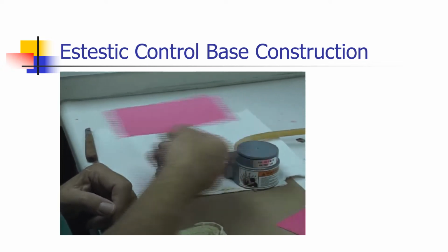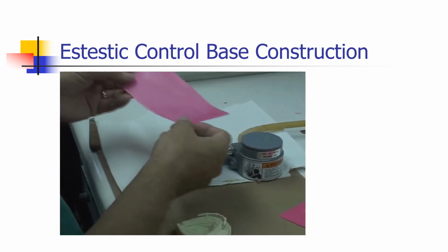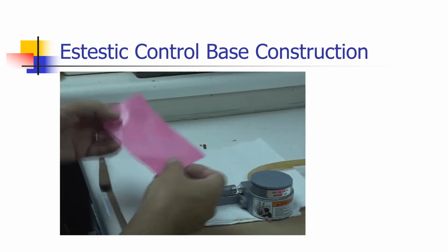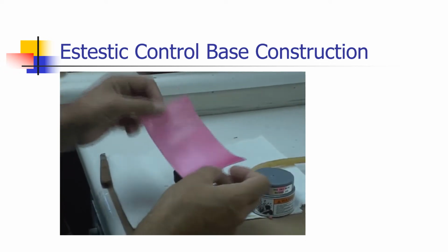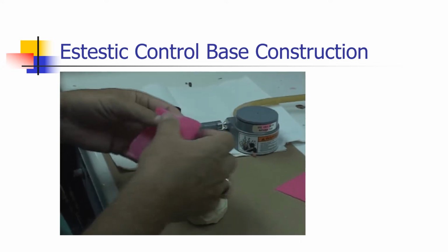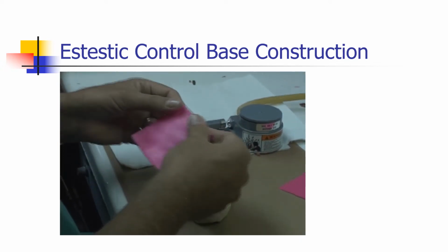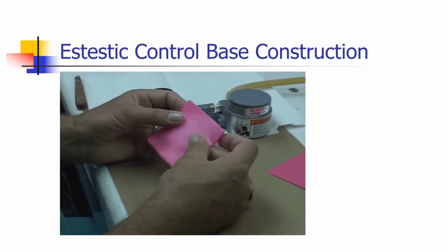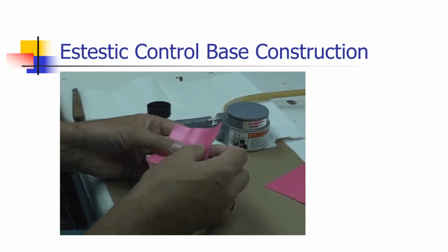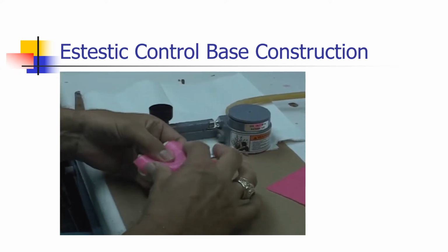The first step in the aesthetic control base is to warm up the wax, and then you fold it in half. So you get this material. See how it doesn't flake when you warm it up. It just stays nice and pliable, and it adheres to itself. What we're going to do is stretch it a little bit here, and then put it over the palate and just place it down and mold it to the stone as you go around.